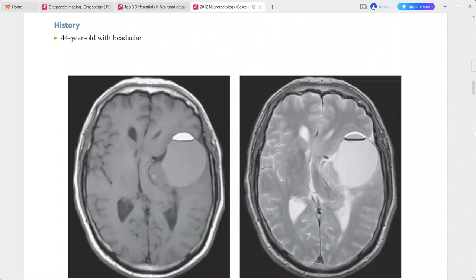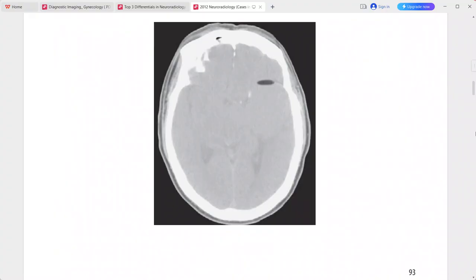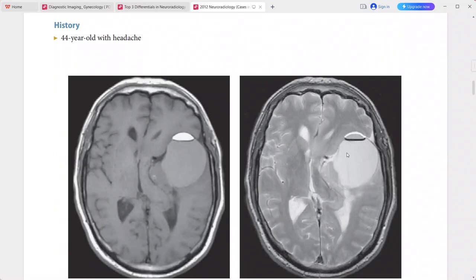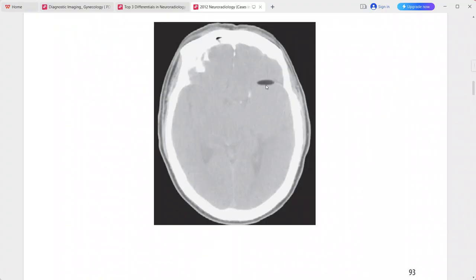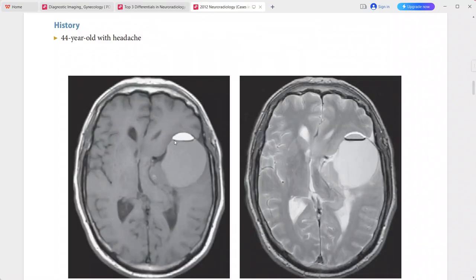Next: a 44-year-old patient presenting with headache. There is a large cystic extra-axial mass within the left sylvian fissure. Both CT and MRI show a fat-fluid level, with fat layering anteriorly within the cyst.